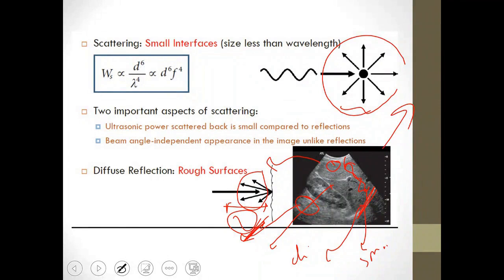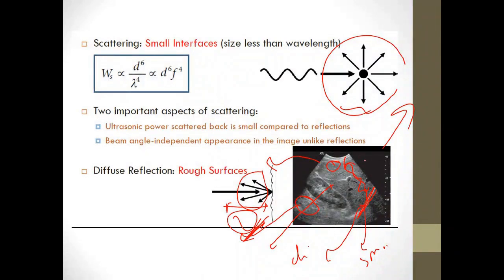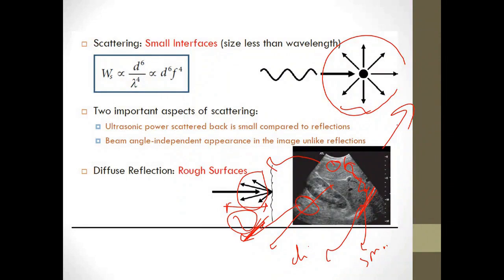Now, in the part between the kidney and the liver, there is also reflection occurring at that border. The impedance does not match between the kidney and the liver. So, every pixel in the image represents a certain intensity. This intensity corresponds to the reflection that occurred, or the type of interaction that took place. The received signal is this.